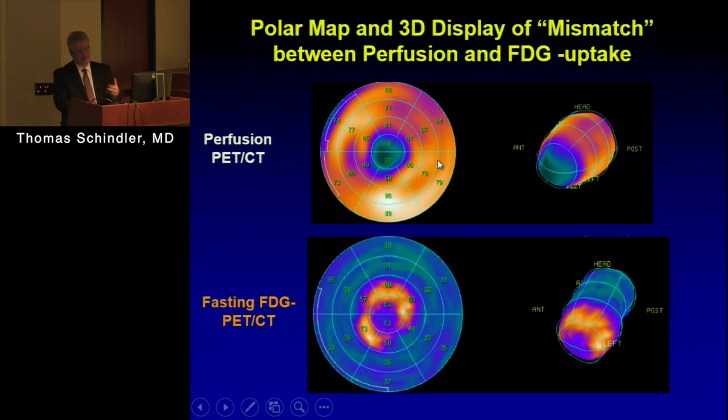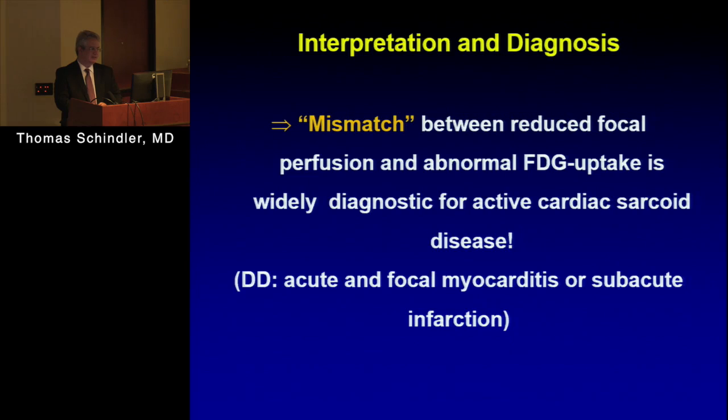The patient also went to cath, which was negative. And so you could now discuss or say maybe it's myocarditis, but myocarditis would not cause such a severe perfusion deficit. So from our side, it was clear that's cardiac sarcoidosis. So the patient underwent then treatment.